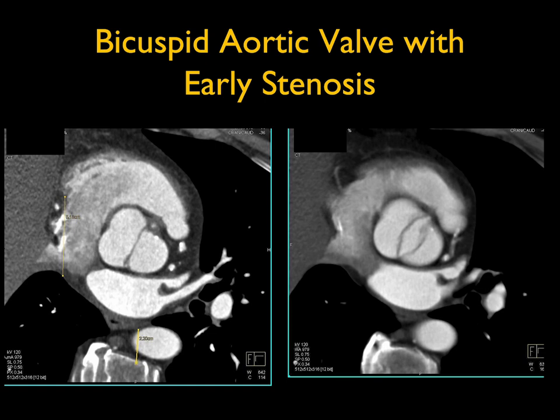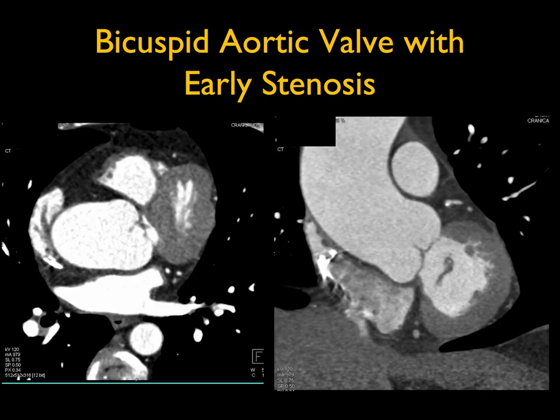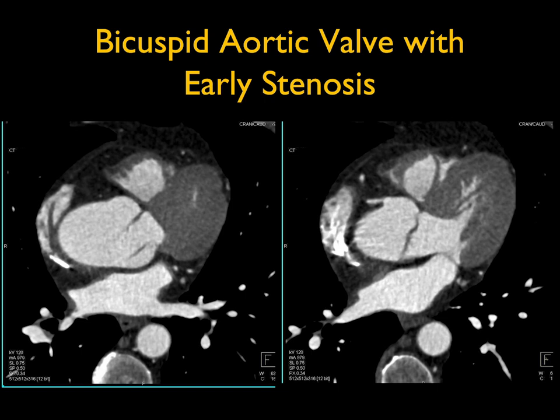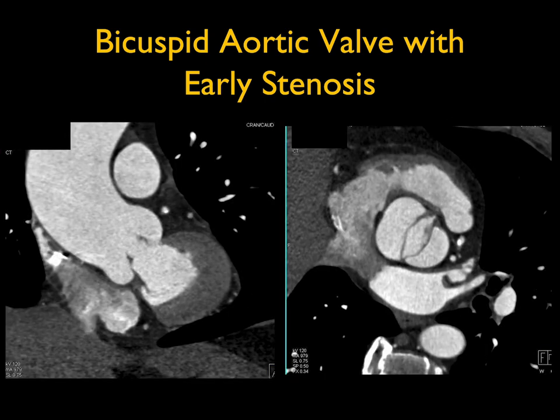You can see the closed and open appearance of a bicuspid aortic valve with some faint calcification consistent with aortic stenosis. Remember, patients with bicuspid aortic valves develop aortic stenosis at an earlier age. On the coronal view the aortic root and ascending aorta are both slightly dilated. The oblique image right through the root looking down at the valve nicely shows the bicuspid valve with minimal thickening and demonstrates the valve opening and closing.